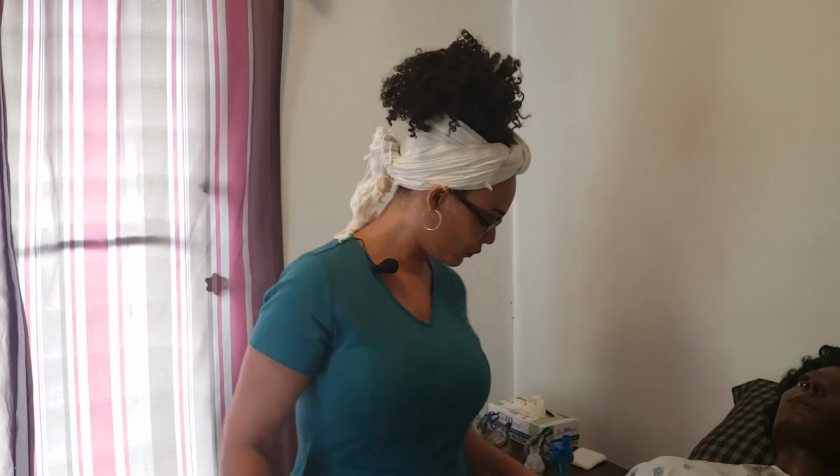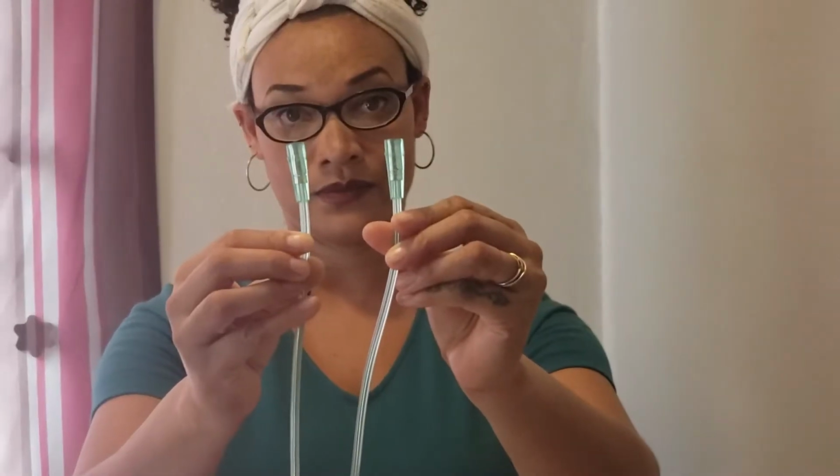You would connect your humidifier bottle to the source by screwing that on. It's a bottle about 6 to 9 inches tall, and you would fill it with water, about 3/4 of the way up. And then you would attach the bottle to a nipple, and then that nipple to your tubing. Your tubing comes with two ends. One end will go to the source and one end will go to the exit, to where the patient receives the oxygen from.